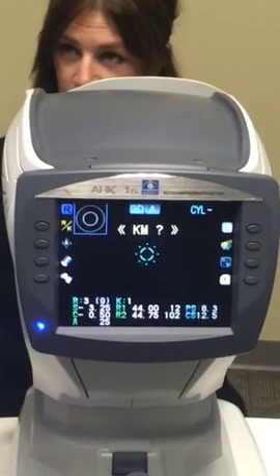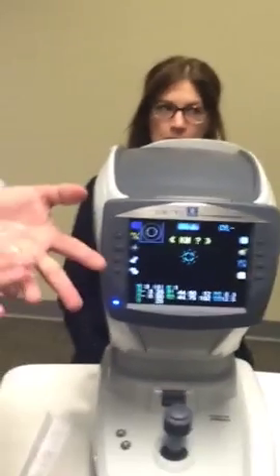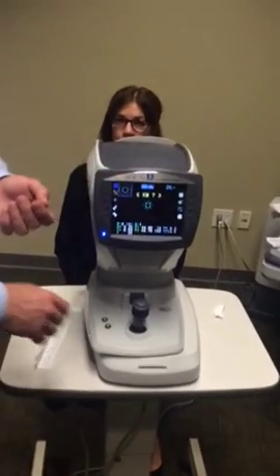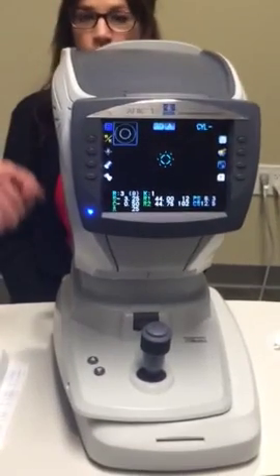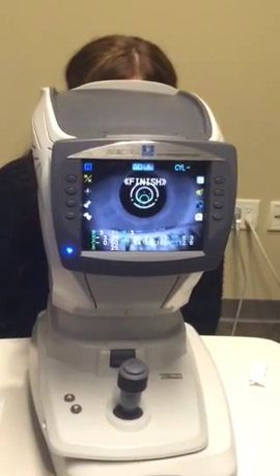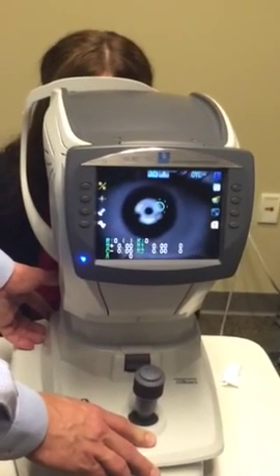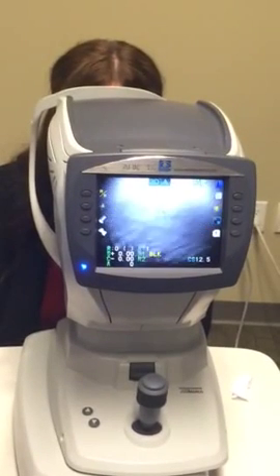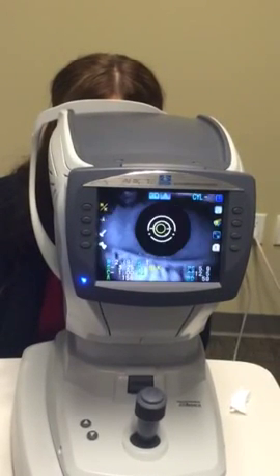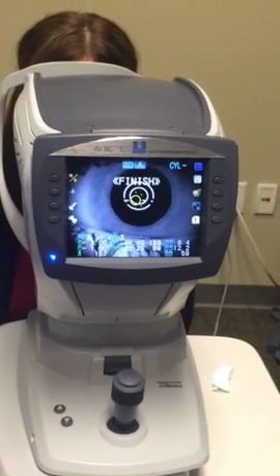Now, there's only one error message you're ever going to get on this: KM question mark, which we already have. All that's saying is during those initial three beeps, the patient either blinked or has dry eyes. When you have this message, have the patient blink, press the joystick button, and bring it back into focus. We can look at the other eye — again, KM question mark — press the joystick button and it'll finish up.